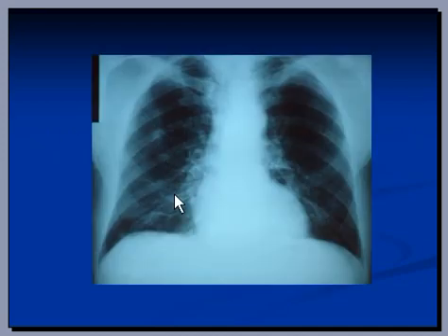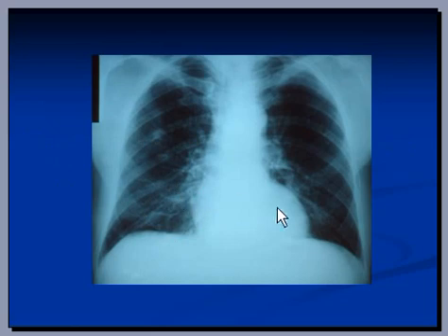So there is a density here, here, and multiple densities in this area and in this area as well.